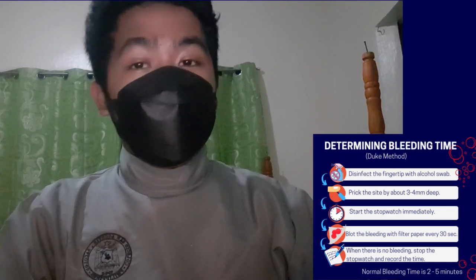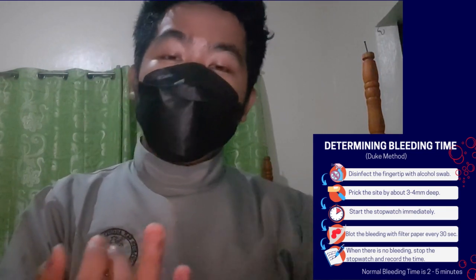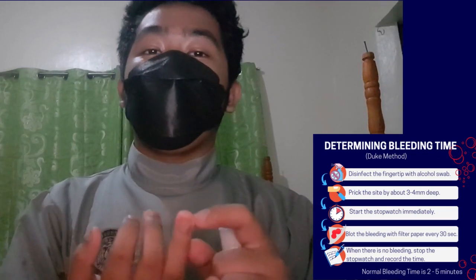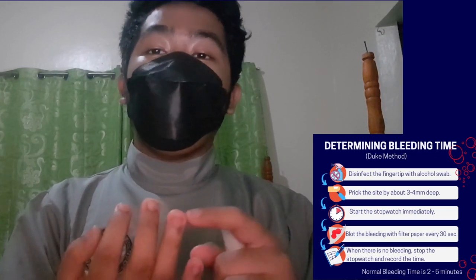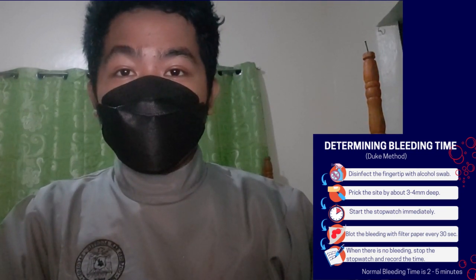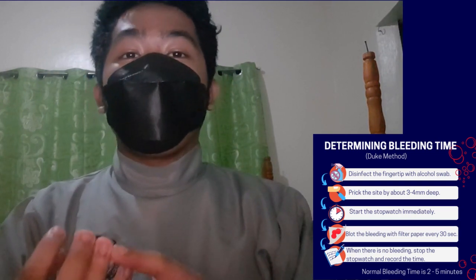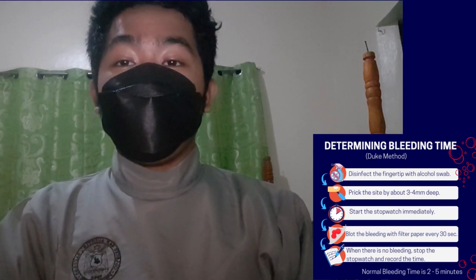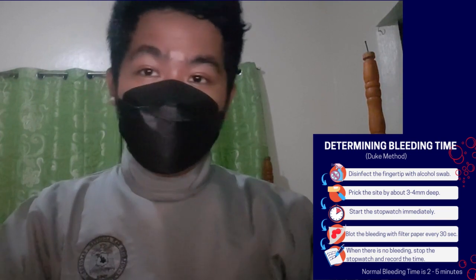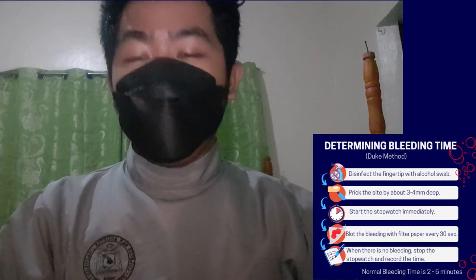With the Duke's method, the patient is pricked with a special needle or lancet, preferably either on the earlobe or fingertip, after having been swabbed with alcohol. But for now, let's use our fingertip — particularly the side of the ring finger. Does anyone know why we use the ring finger?